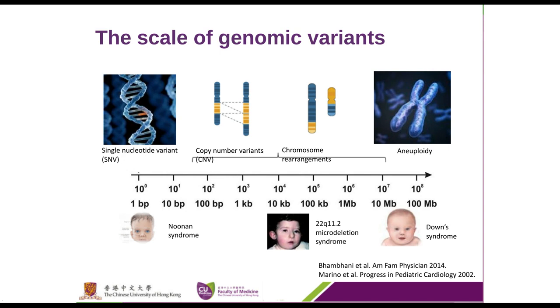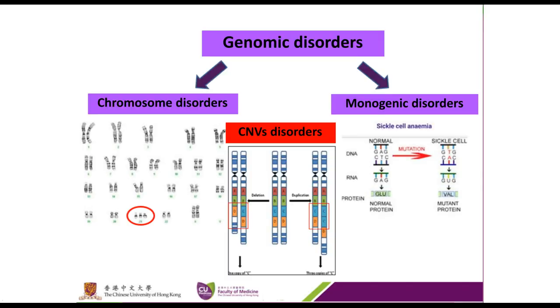And because of this need, when we categorize them by the type of method we can use to detect them, we can see that since the 1970s, for any chromosomal disorder, we have asked our skillful cytogeneticists to do cell culture, and then we can identify changes as tiny as what I show you in the red circles, that there are 3 copies of chromosome 21, representing one of the most common trisomies.